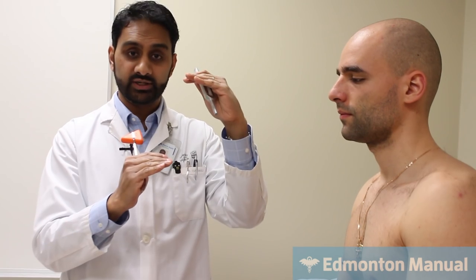Then you're going to use this to distinguish between sensorineural hearing loss, where the nerves aren't transmitting the noise, or conductive hearing loss, where due to recurrent infections or something else going on within the auditory system, think of it as excessive debris blocking conduction, there's actually more material to conduct sound through bone as opposed to through air. One of the key principles is normally, air will conduct better than bone. When you have sensorineural hearing loss, both of those are reduced. So you still get air conducting better than bone, but it's just reduced on that side. As opposed to conductive hearing loss, where you actually get decreased air conduction and increased bone conduction.